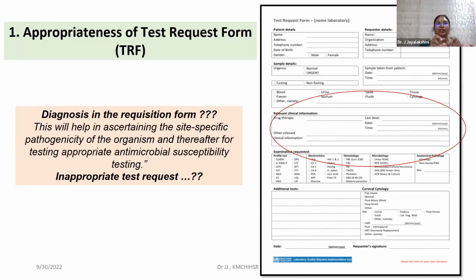But because the specimen for the clinician looked different in different sites of its infection, they have picked it up and put it in separate bottles. It would have been good if they had just put it in one single bottle also. And if they want to do additional tests on that, this would be useful. Sometimes we want more samples, but they don't come to us.